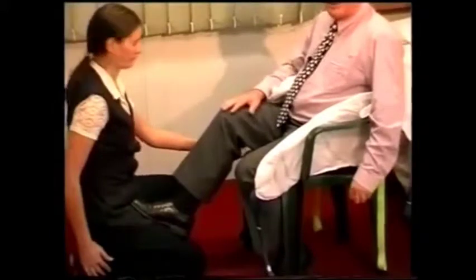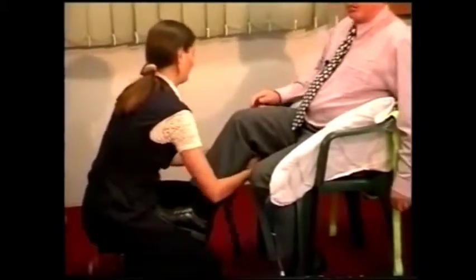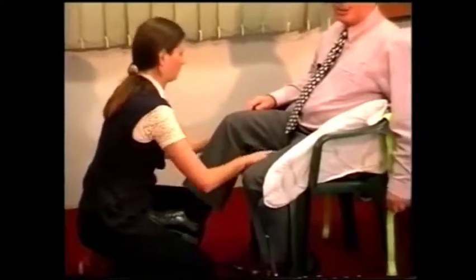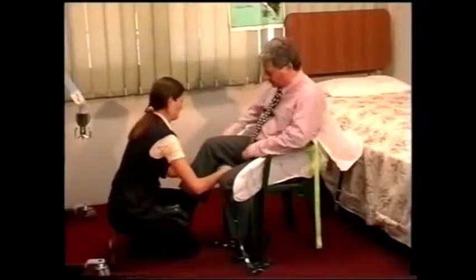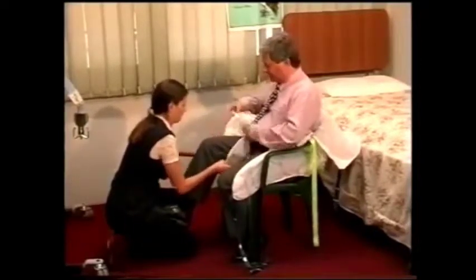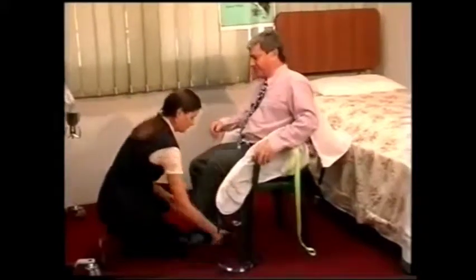So, Vicky is kneeling down in front of me, and by resting my foot on her leg, she's not having to take the weight of the leg, and it gives her plenty of room in here to get the sling leg around. Just pull the sling leg around, and that's it, right here. And then, can't change legs, we'll do the other one.